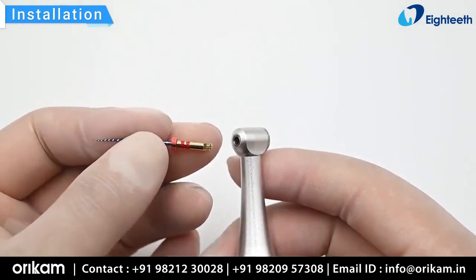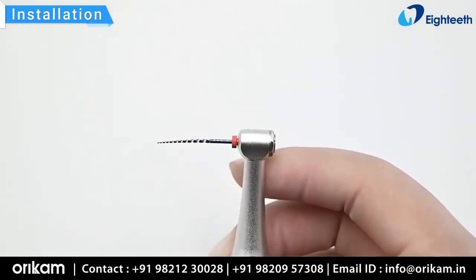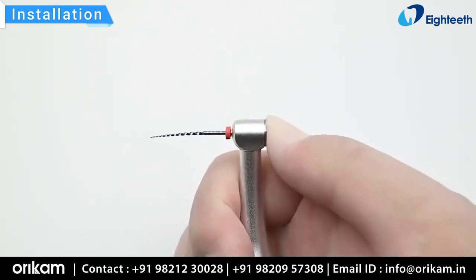Rotate the endo file gently to find the right position, then push it gently inside the contra angle. Press the button to remove the endo file.